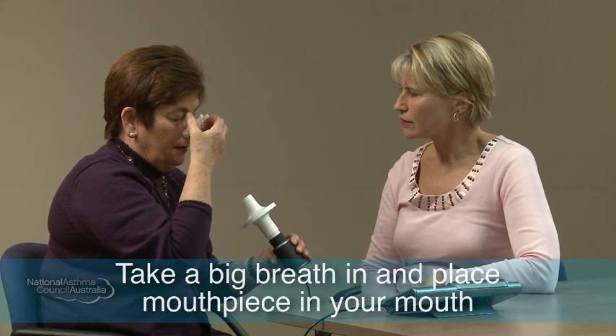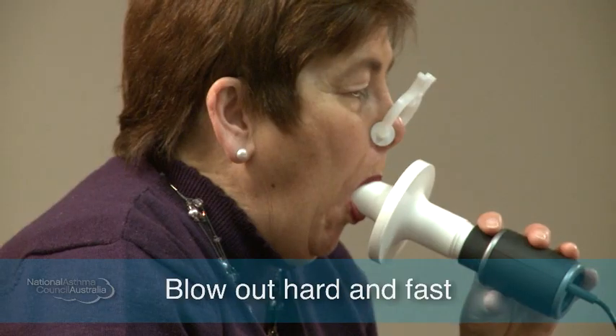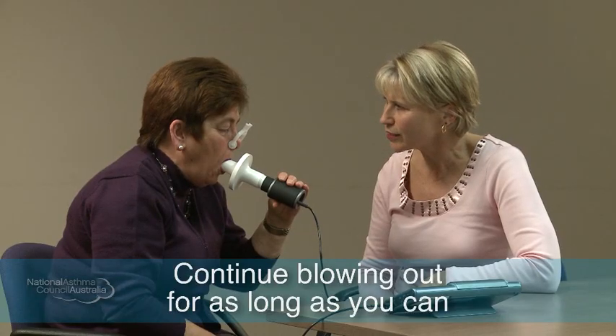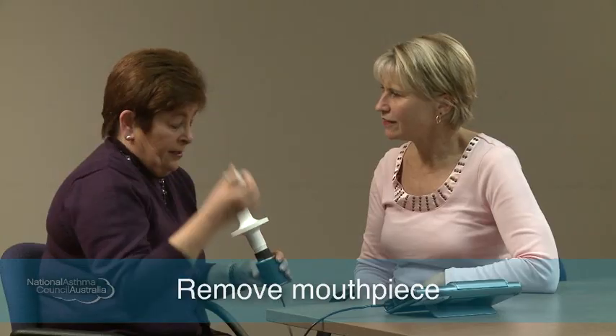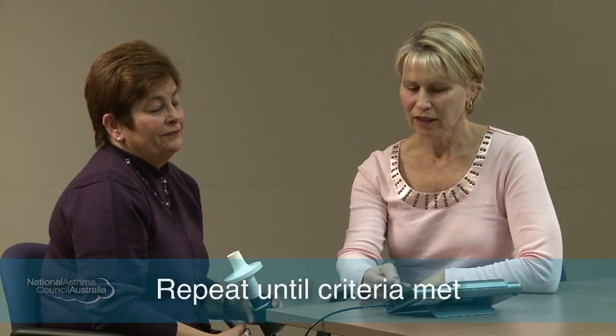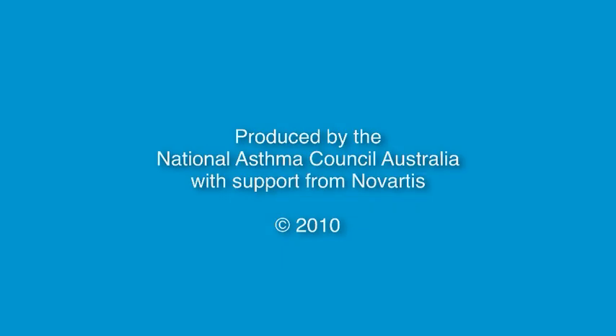When you're ready. Big breath in and blow! Push, push, push, push — keep going, keep going, keep going. You're doing a great job, all the way. And big breath in and blow. Well done. We've got two blows that are reproducible, so that's excellent. We can stop now.